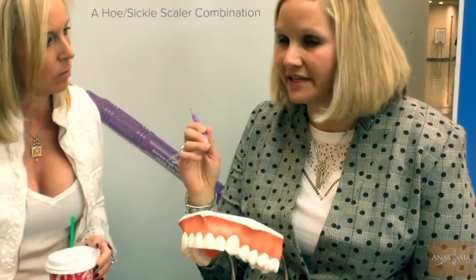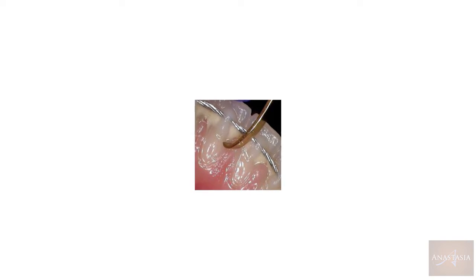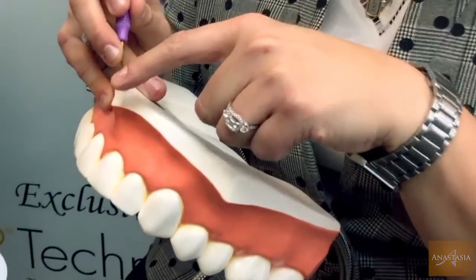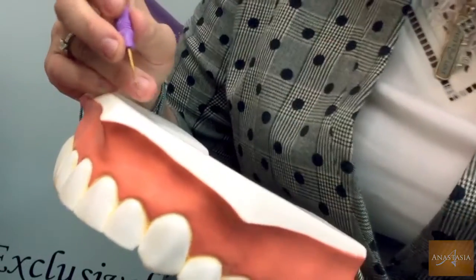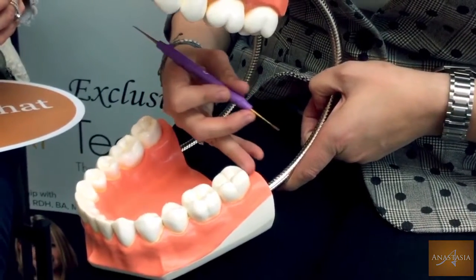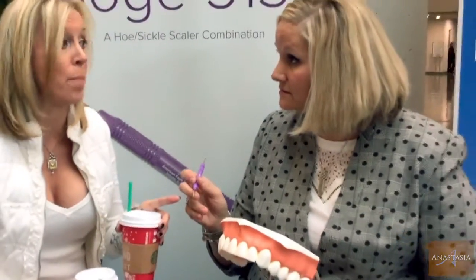These XP instruments really grab a hold of stain and they grab a hold of that real fine tartar that sometimes you can't get a hold of with a regular stainless steel instrument. I wanted the inside edge of the instrument to have the sharp cutting edge. The outside of the instrument is smooth but the inside has the cutting edge. So you can even bring it back here to the distal, the second molar, and really work on this area without worrying about damaging the tissue that's along the cervical margin.